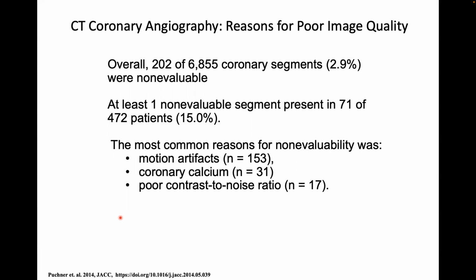Normally it's end diastolic, the resting state, when you take this picture. Some patients, if their heart rate's too high, don't have an end diastolic state that is that long. So I would imagine in most of these, they put them on a drug that lowered their heart rate. And so you get the heart rate down to 65, and in these old scanners, you get good pictures.